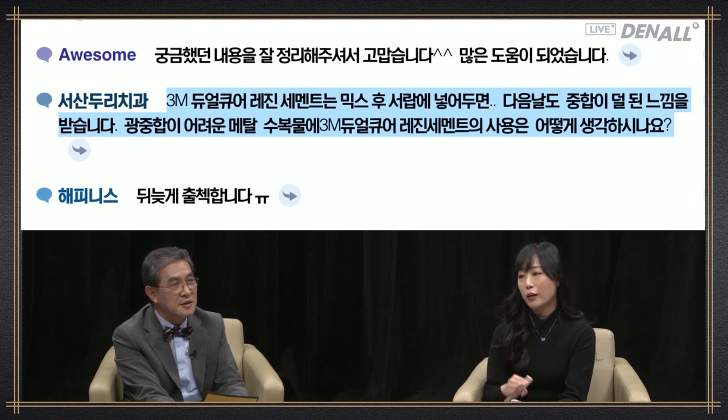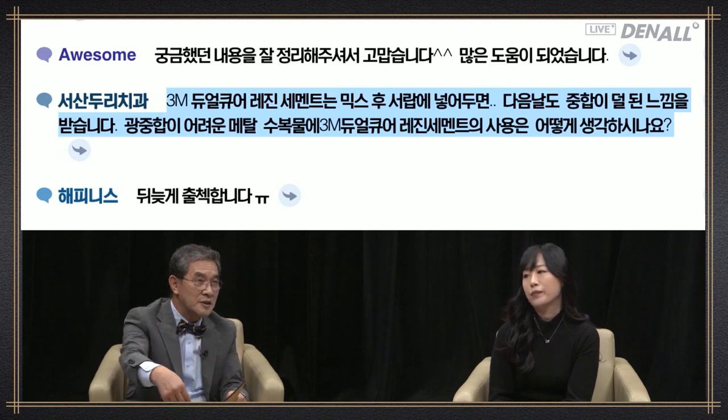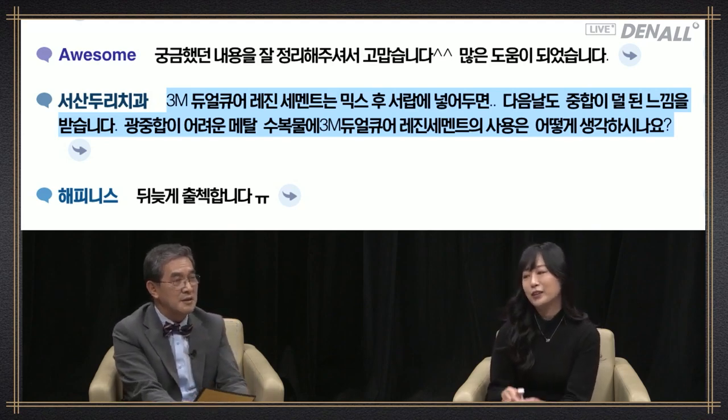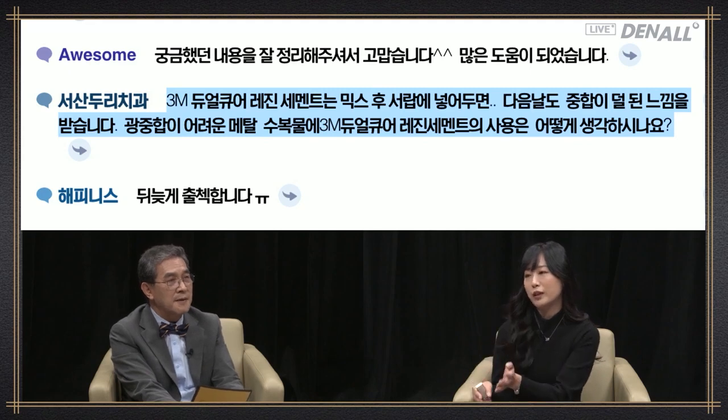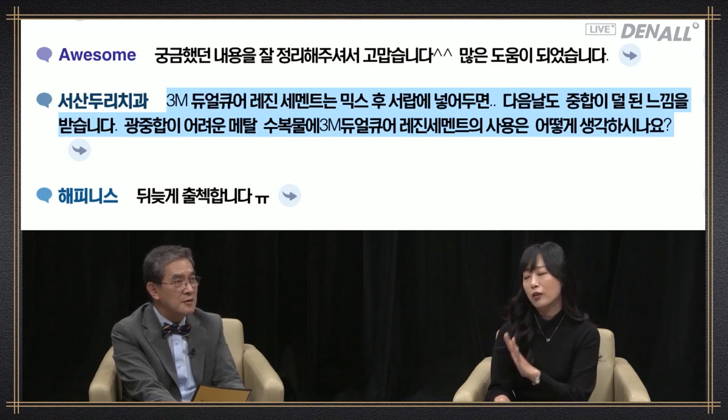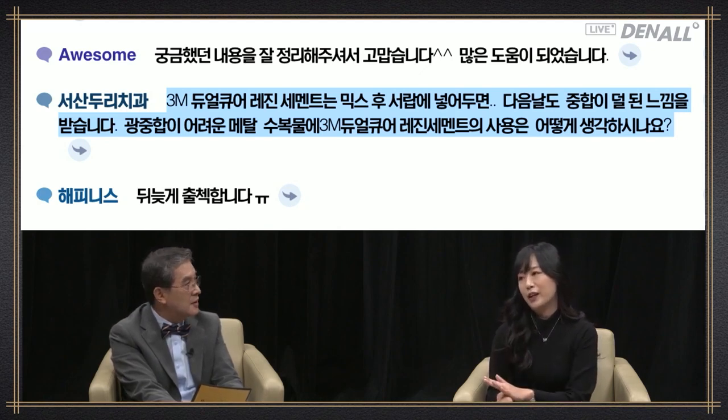Light curing is the beginning of setting in the case of dual curing. Light curing was not there and polymerization was minimized, and therefore it was barely done. You need to do light curing in the beginning to make it start. If you leave dual cure resin cement in a shade or a drawer and there's no light curing, polymerization does not occur much.